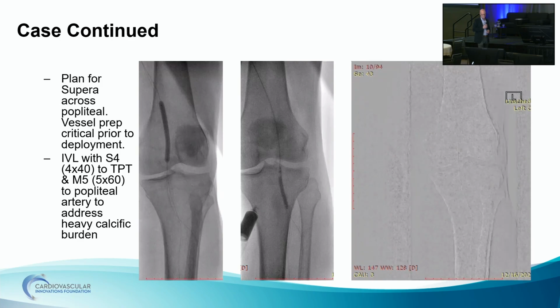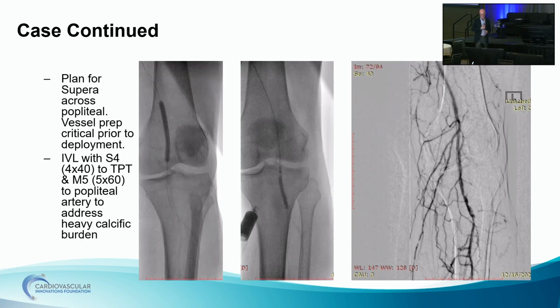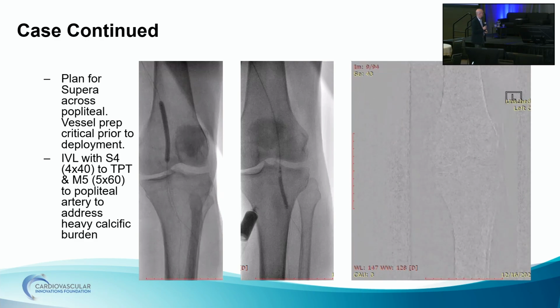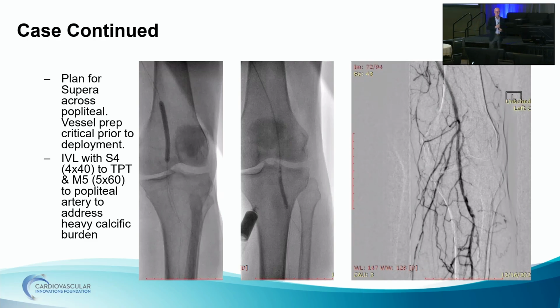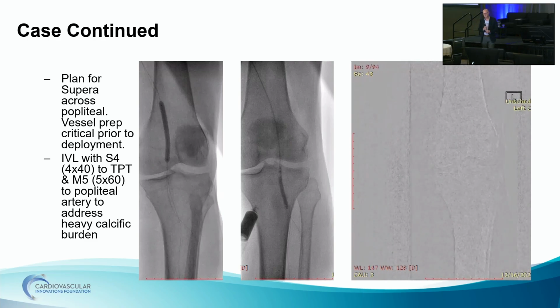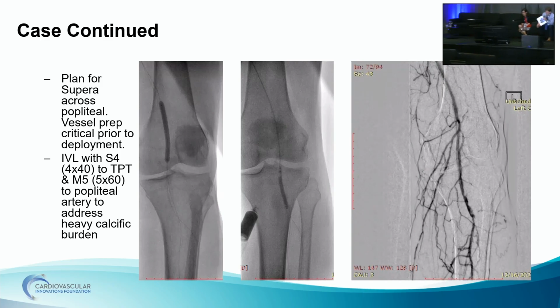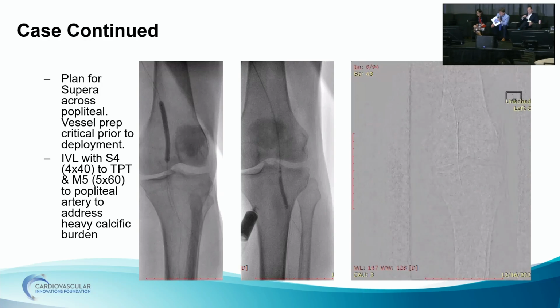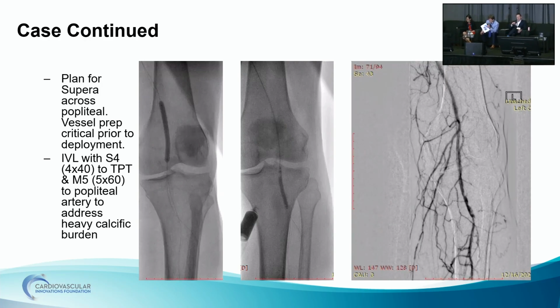I would like to see the angiogram before, but you're potentially going to have to IVUS. And one of the things that makes your life a little more difficult, not only is she wiggling her leg, I assume, but when you go antegrade, you don't have the profunda collaterals, and sometimes the flow makes it look a little worse than it is. But there's something going on downstream, whether it's a propagated dissection or distal embolization.